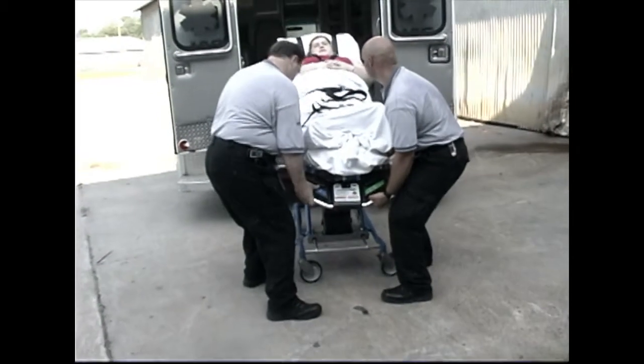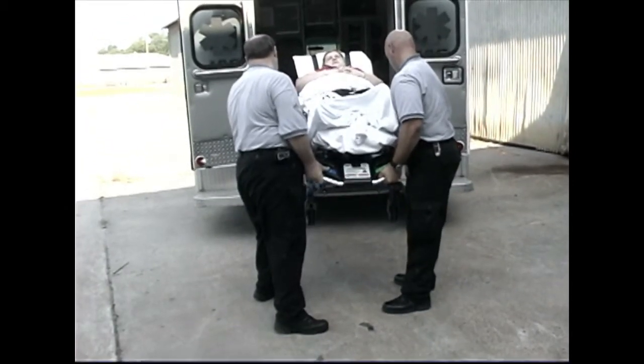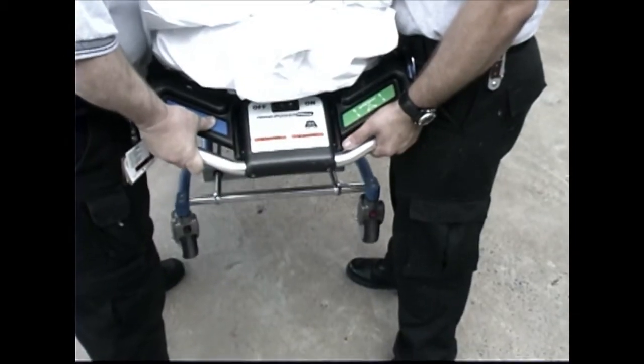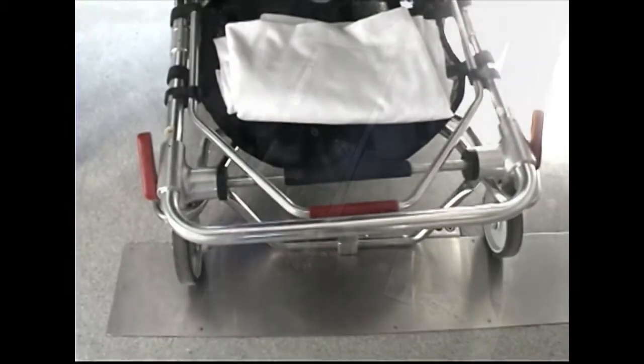Both operators can then work together to elevate and hold the foot-end of the cot level with the ambulance floor. The control operator presses and holds the blue lower load touch pad to fold the cot. Push the cot completely into the ambulance and secure the cot in the cot fastener.